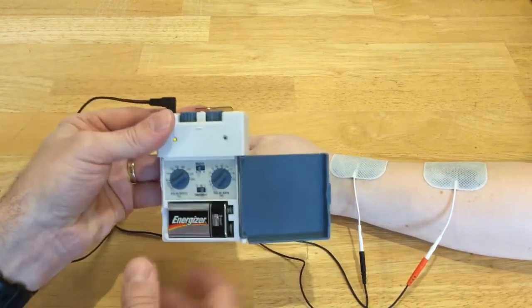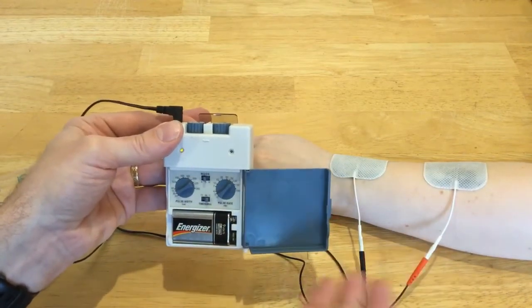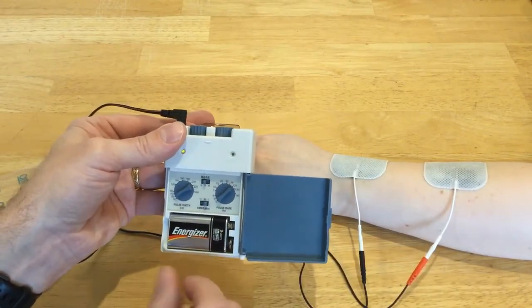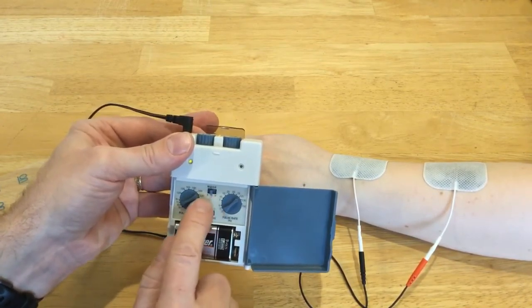Once you've got everything set up and your patient says, yeah, I feel it, and it feels like it's going through the area of pain, then you can play around with the mode and switch it to modulated or burst.